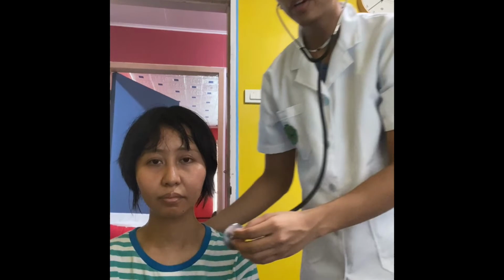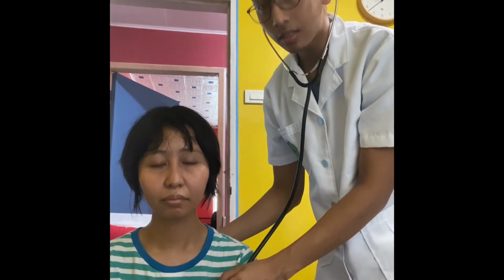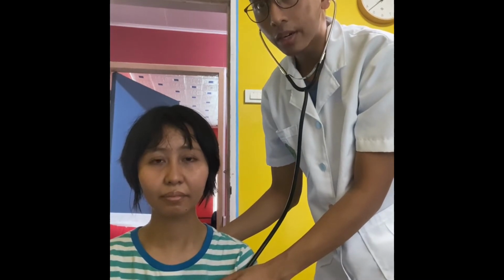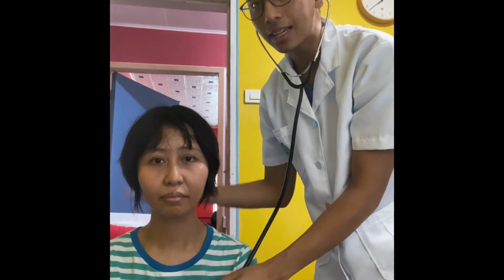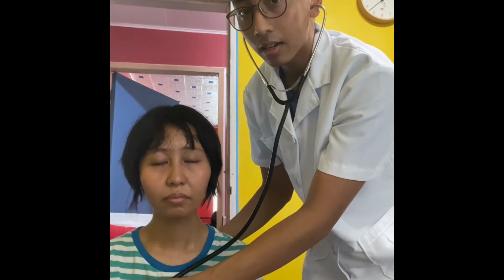Then, moving on, just slightly above the nipple. Inhale, exhale, miss. So, we're now assessing the anterior segment of the upper lobe when we move here. Then the other side. Inhale, exhale.